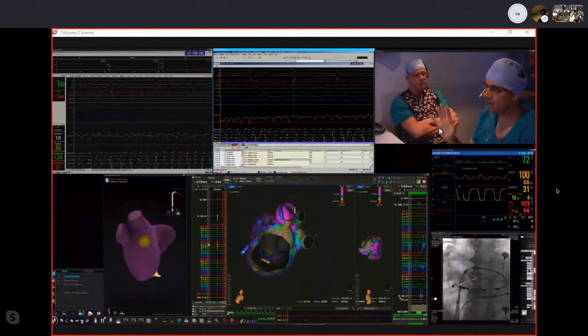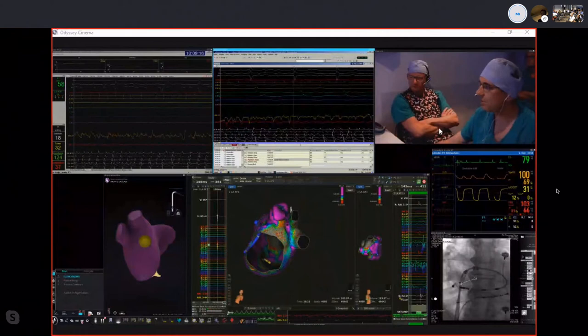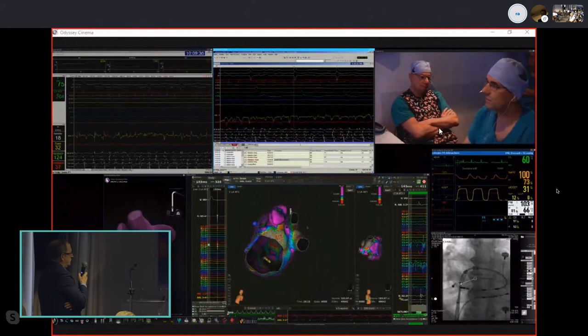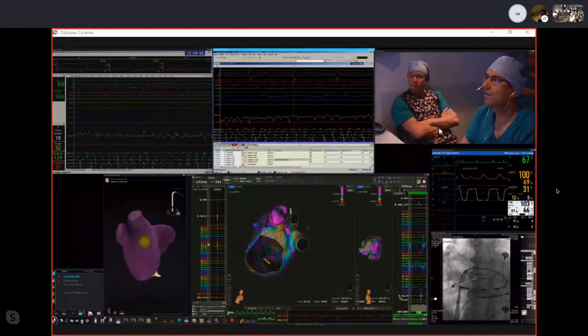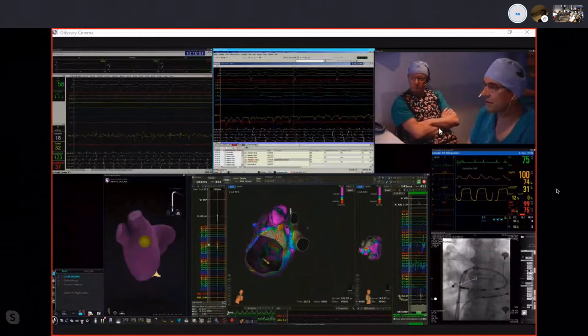Now, in this 30% category, there were only 10% which were explained by far fields from the appendage. And this was demonstrated by differential pacing, of course. So there is a 20% more accurate diagnosis of persistent connection of the PVs when you use the basket catheter, the Orion, versus the lasso. It sounds as you rely on Orion as a good discriminator, and you would consider it a valuable target. Yeah, I think that for a local electrogram interpretation, it is maybe the most reliable because of the size, once again, the size of the electrodes, their unidirectional characteristic, but also the very closely spaced bipolar electrograms.